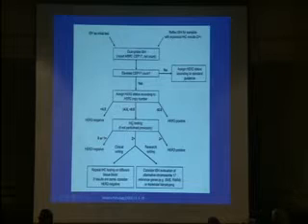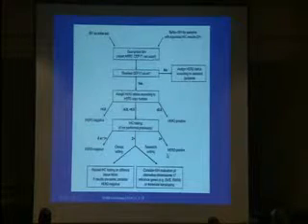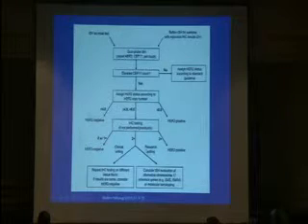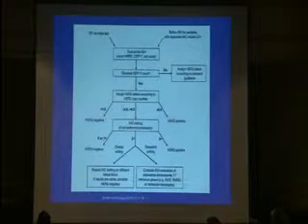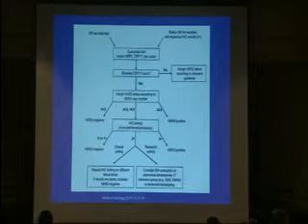You might have to do another immunohistochemical test if you didn't do it in the beginning, or repeat it. If you get a 3+, then regardless of the copy number, you call it a HER2 positive tumor. If you get a 0 or 1+, that's a HER2 negative tumor. If you get a 2+ again, in the clinical setting, you might want to repeat the test on a different tissue block, and if the results still come back equivocal, then consider it HER2 negative.